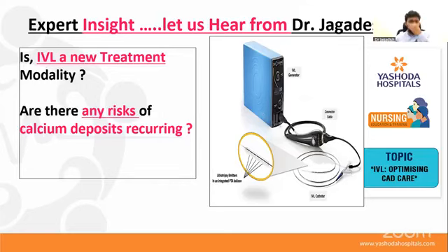And people do ask us, sir, if you do IVL and break the calcium with a balloon, will the calcium recur? The answer is yes. So we are just breaking the calcium that's already deposited, but then calcium reoccurs.